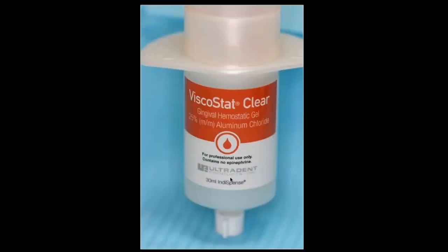So one of the things that I use if I have bloody gums is Viscostat. Viscostat is an Ultradent product, and it's really, really good. I like the clear, and what I do is I tell the patient I use an infused brush with a syringe. Of course, everyone knows Ultradent is the king of syringes, and I just place that on that gum, and if it's bleeding a lot, I'll dab it a lot and put a gauze on there and let it set for a few minutes. I don't have to pack cord, and I will tell the patient it may taste a little bitter, and we go from there.